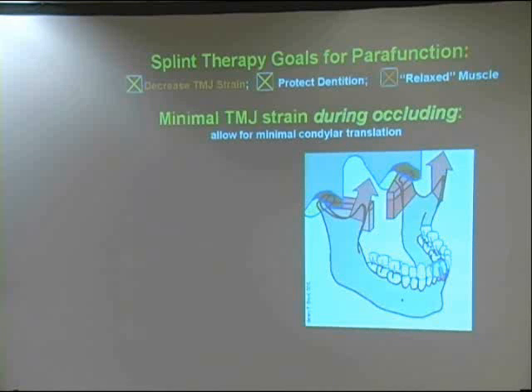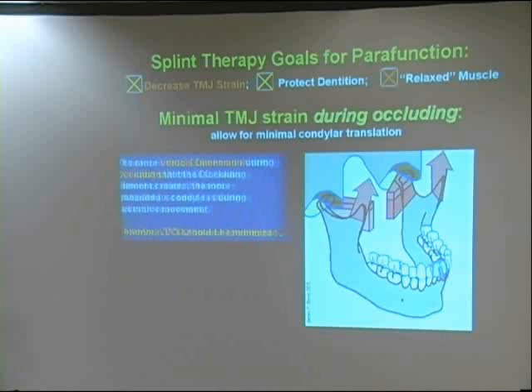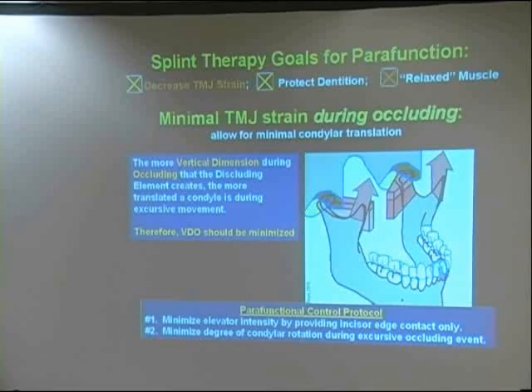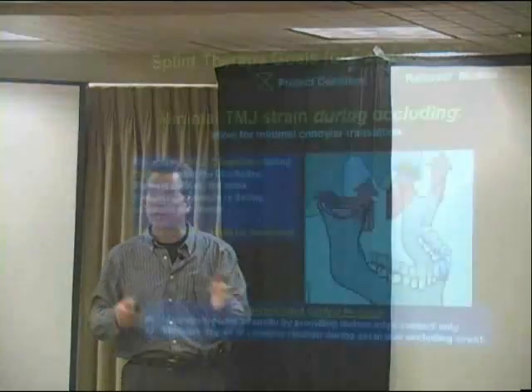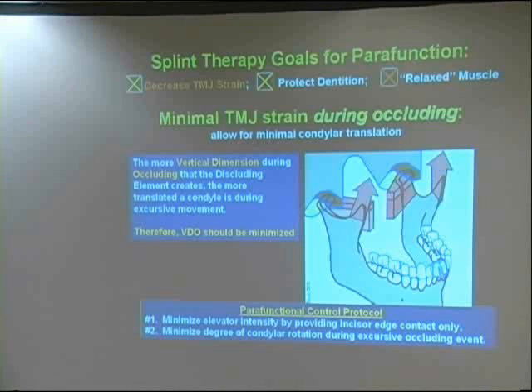So another concept or goal for a splint is to decrease joint strain. With an NTI device, you can increase it if you goof it up. It all has to do with the vertical dimension of occluding. We want to minimize the vertical dimension of occluding to minimize the rotation during the event so your condyle is not hung out to dry in these excursive, protrusive events.